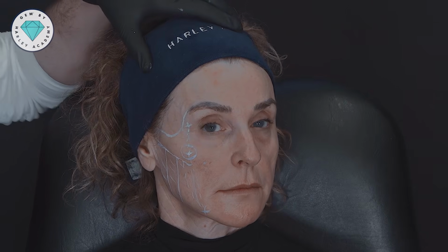Remembering that in this part of the face, we can treat in the SOOF or we can treat in the pre-periosteal fat. In this case, I'm actually interested in as much structure as possible. So I'm going to be treating in the deepest plane, which is the pre-periosteal fat, which is actually a structure that lives even deeper than the SOOF.